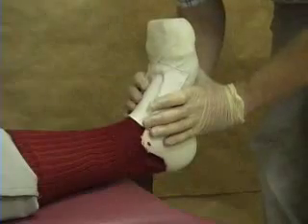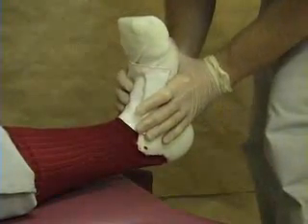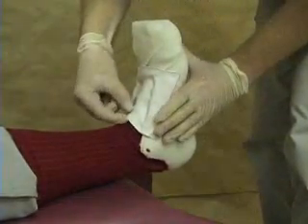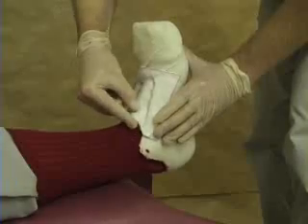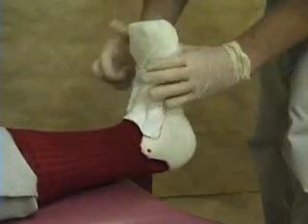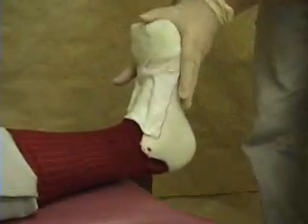What I'm going to make sure can happen also is that when we bend the subject's foot up as far as we can without pain, just to provide enough space here at the top where it can become quite uncomfortable if it digs in. So we'll just let that cool and harden.